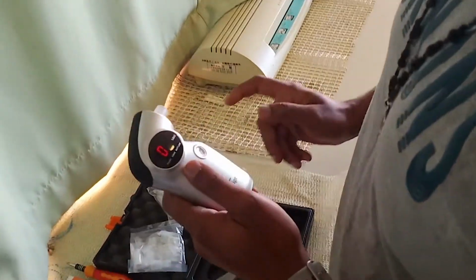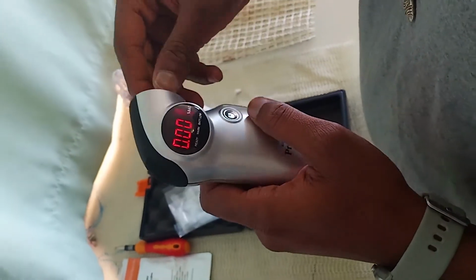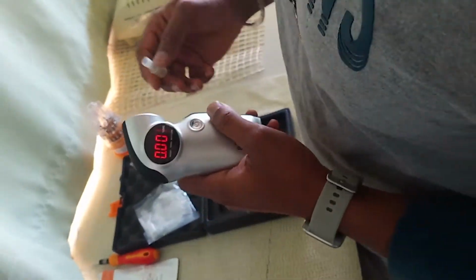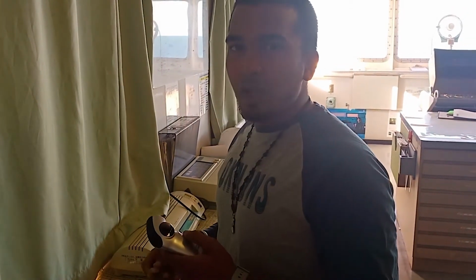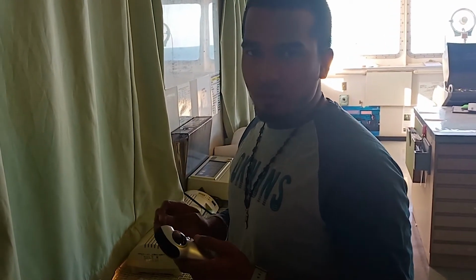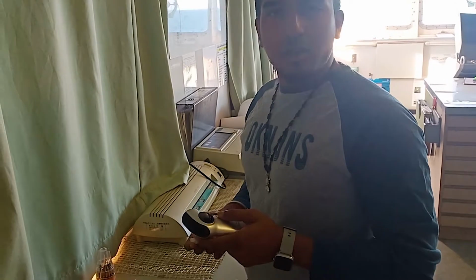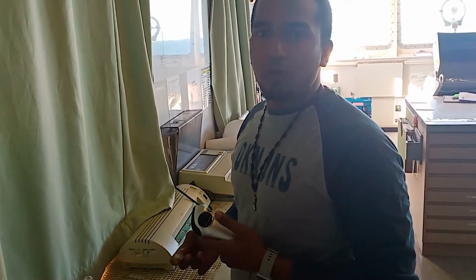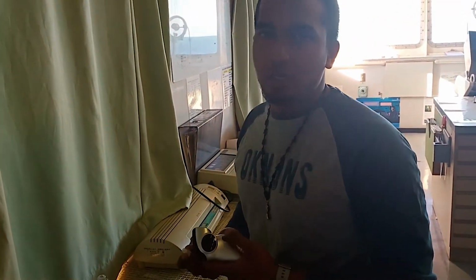Now it's calibrating. 0 0. So in this Alcoholmeter, we got a continuous beeping alarm. It means for that much period of time you have to continuously blow. Once it gives two beeping signals, it means the end of your blowing. You can stop and you can wait for the reading. That's it. And every time you have to switch it on again, like the Alcoscan AL7000. You have to wait for it to warm up, and then the equipment will give the indication of ready, and you can start the blow again.